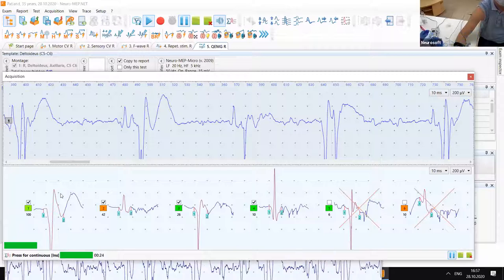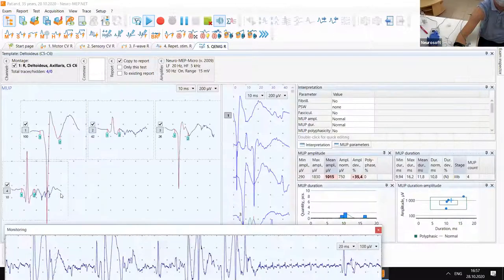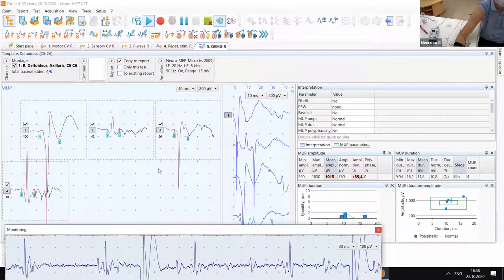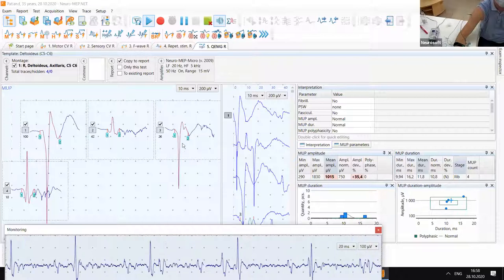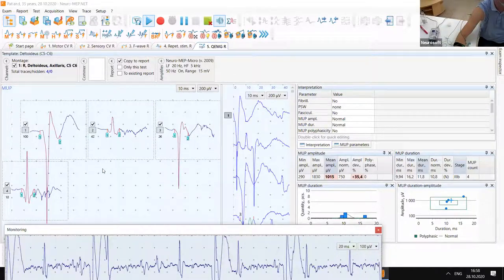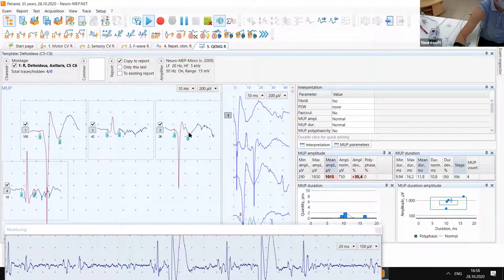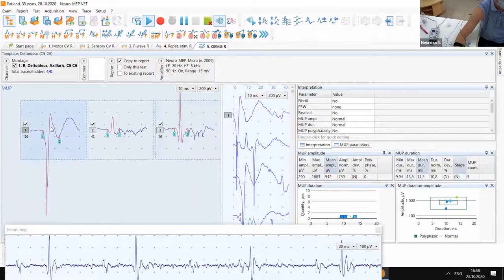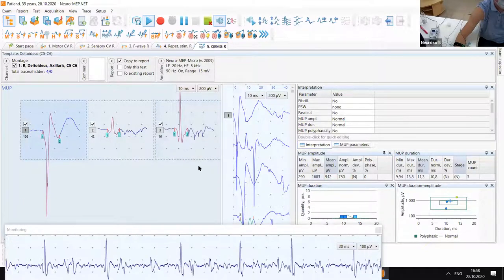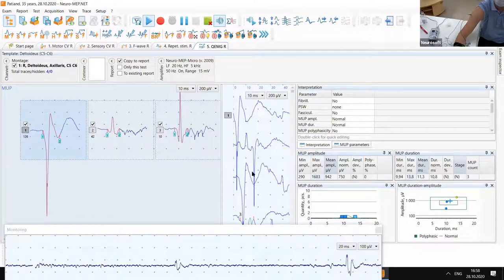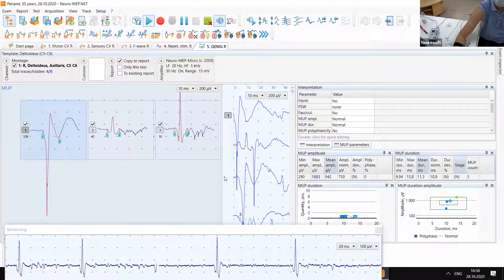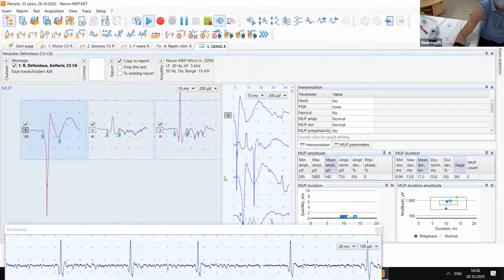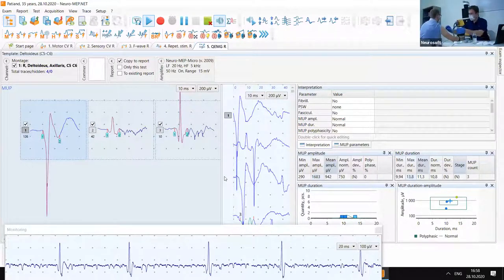We start. We get, they look alike. We get three motor unit potentials. Then we need to change the position of the needle a little bit.